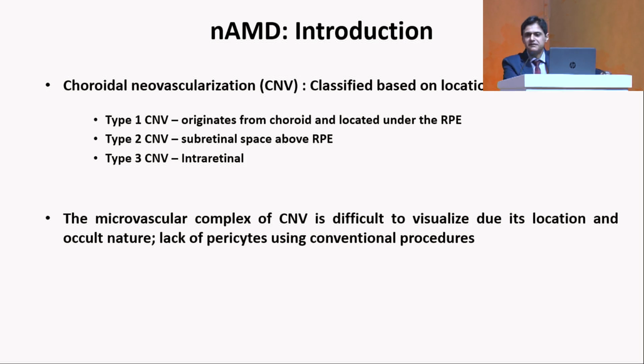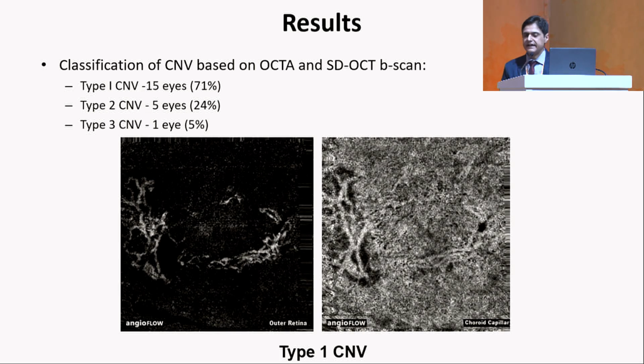So, sometimes the detailed examination of the microvascular complex is not visible on a FA or ICG, but with OCTA we can get very detailed segmentation of the superficial capillary, the deep capillary, outer retina, choriocapillaries, and it's continuously improving as highlighted in the previous presentation.